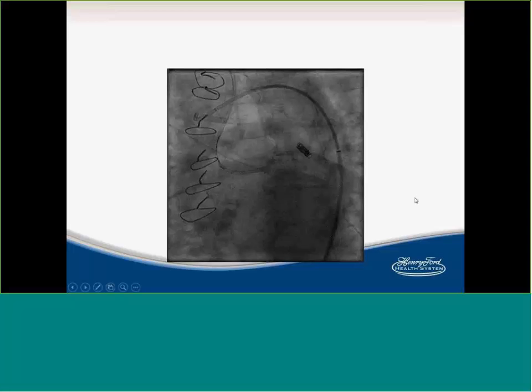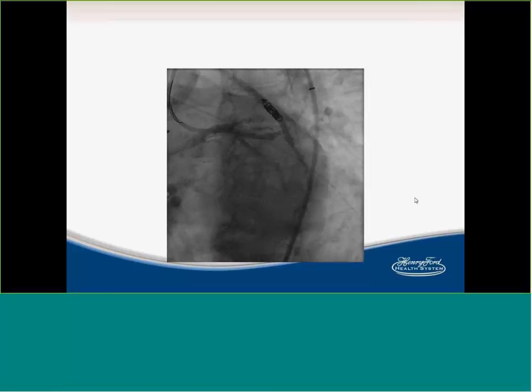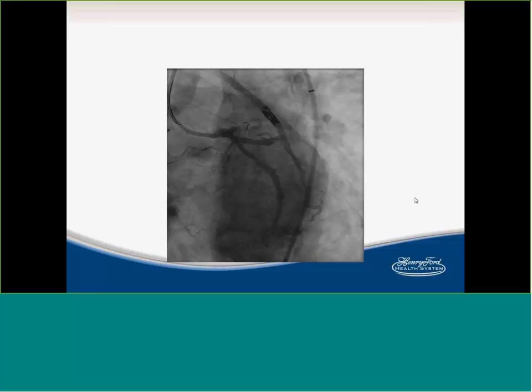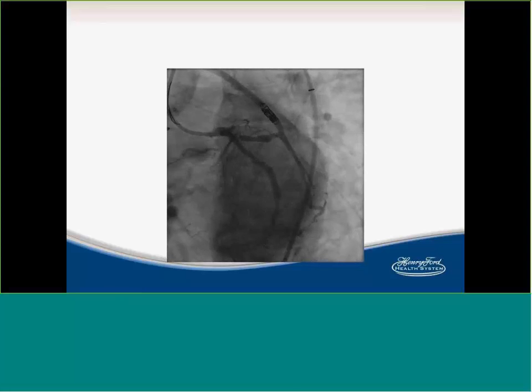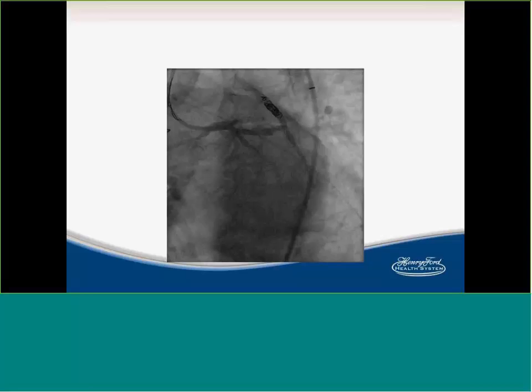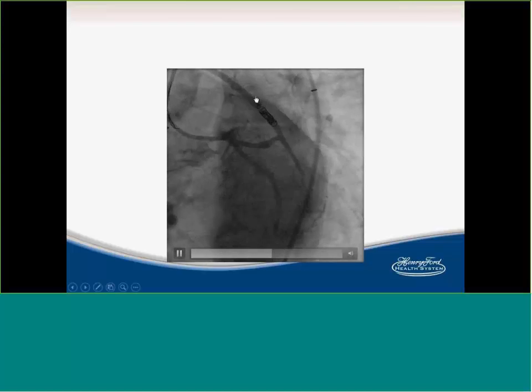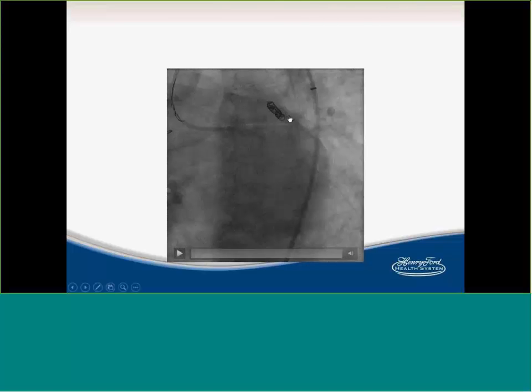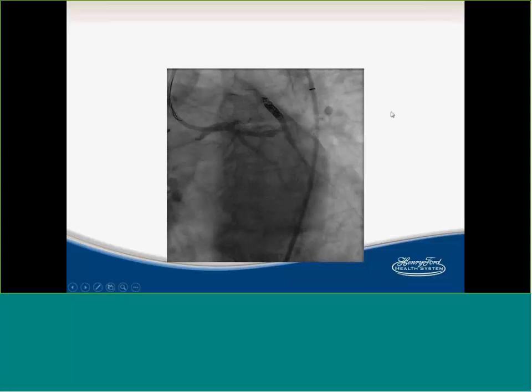So it makes you wonder if it's better to just use the long coils and avoid the smaller ones. The longer ones are probably more likely to stay in place than move. Exactly. Yeah. So did you put another one proximal to jail those figure 8s? No, I did not. Once I saw this, I stopped. I injected more carefully the next time, but it still kind of pops open, so I put a big one distally so I can jail those figure 8s. But I think I should have put another one here, but we had to run to IR because I did not have my interlock. Sure. I didn't want to run again. So we said, okay, as long as it's staying in, we're going to leave it alone.